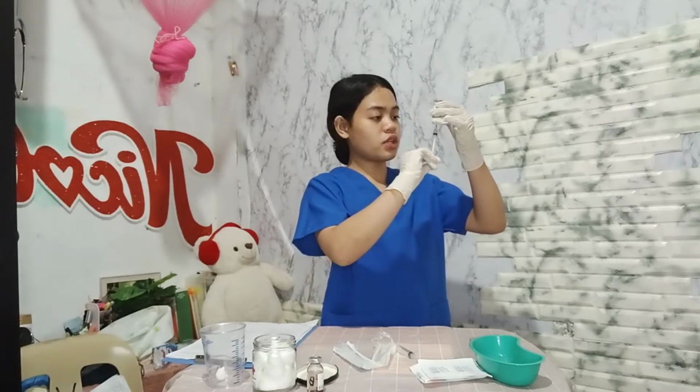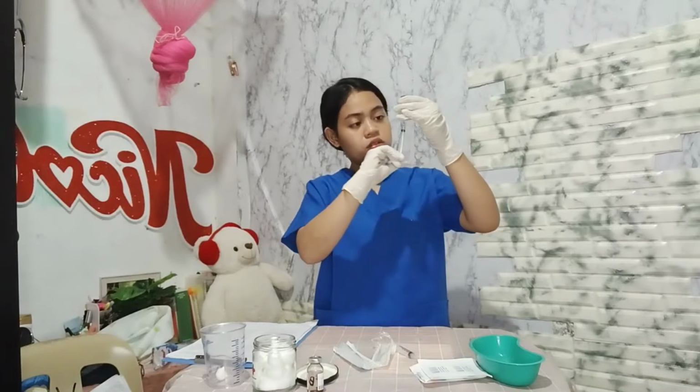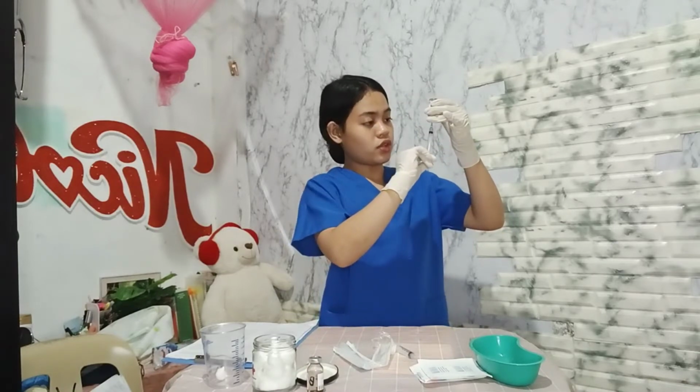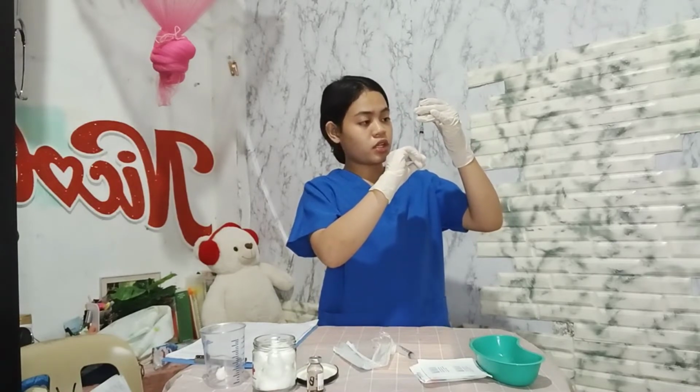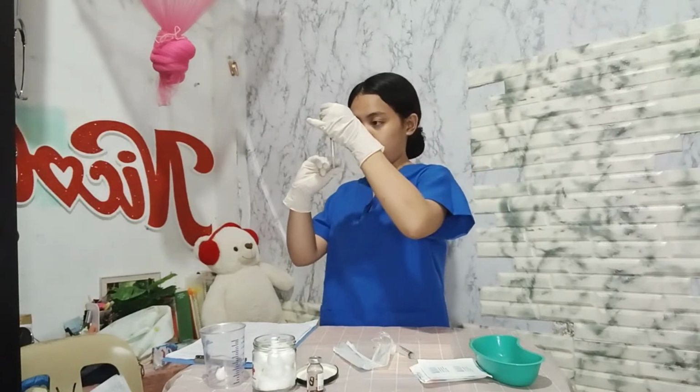Hold the syringe and the vial to determine that the correct dosage of the drug is drawn into the syringe. Then eject the air remaining at the top of the syringe into the vial.